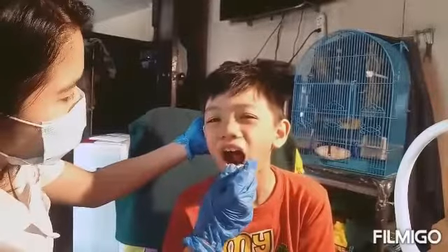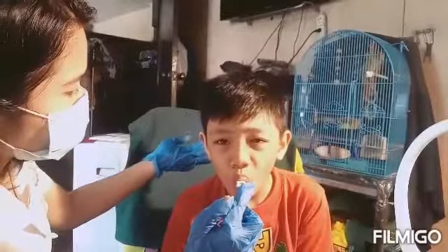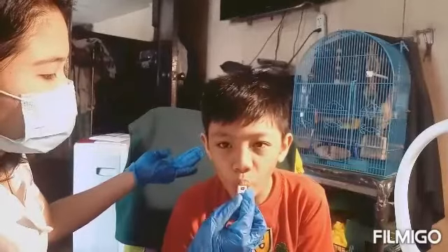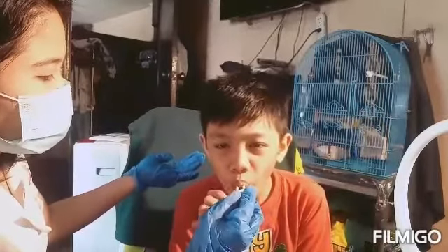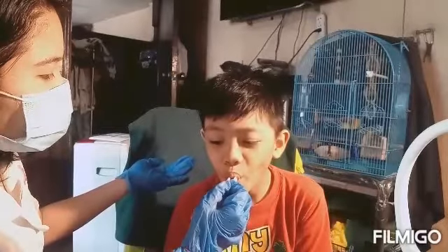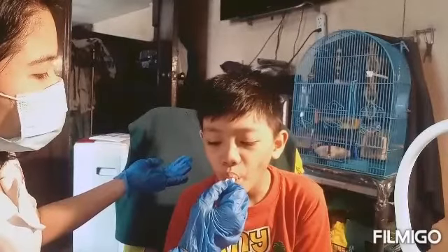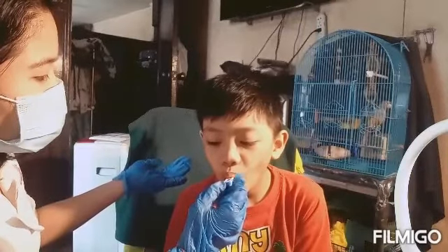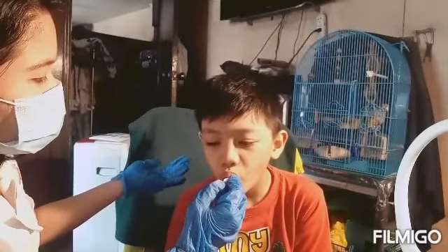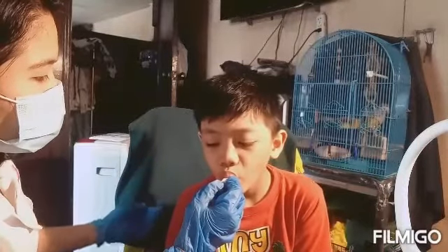I asked Nathaniel to open his mouth and put the digital thermometer under his tongue. With Nathaniel's mouth closed, we will leave the thermometer in place for about 1 minute until we hear the beep. The average normal body temperature taken orally is about 37 degrees Celsius or 98.6 degrees Fahrenheit. It usually rises during the day from a low of 36.5 degrees Celsius in the morning to a high of 37.5 degrees Celsius in the late afternoon.